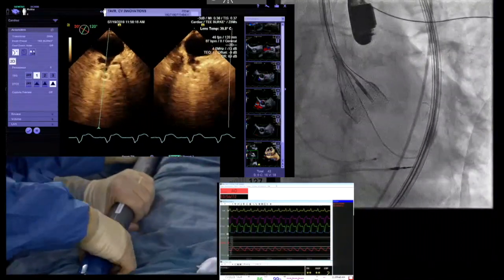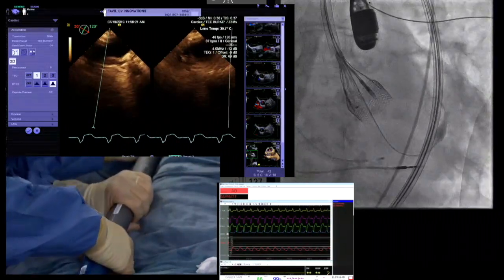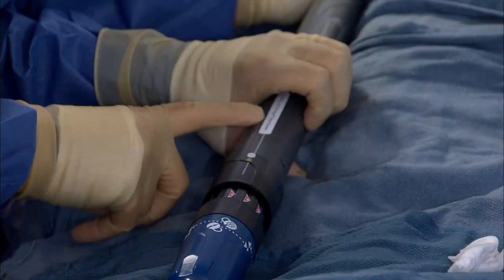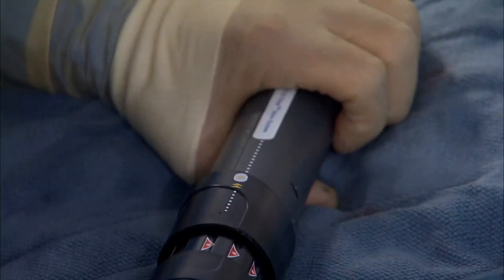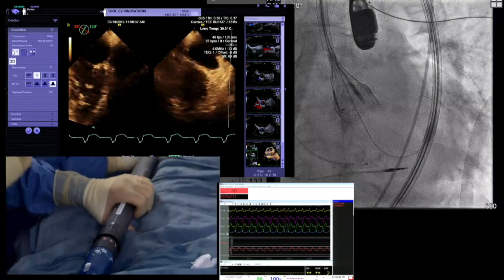You can see the release pin is coming back. And it's back. Coming back, coming back. And now I'm going to match up my lines. My lines are matched up. Look here. Zoom in, please. So all of these lines are matched up. There's actually a pause sign on this that tells you that's when to pause. Bob, one last look, because now we haven't released it.